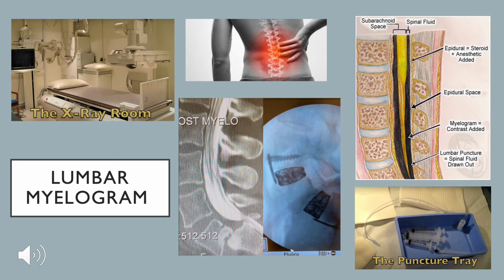The patients are to lay on their stomach, exposing the lumbar to be sterilized. Once that is done, the radiologist looks at the spine under fluoroscopy, obtaining real-time moving X-ray images. Lidocaine, a local anesthetic medication, is administered in preparation for a spinal needle.